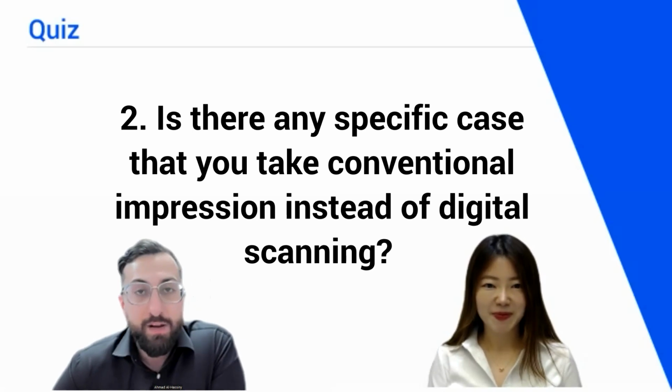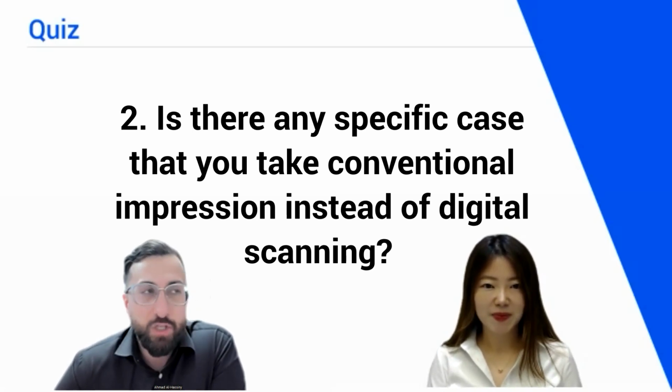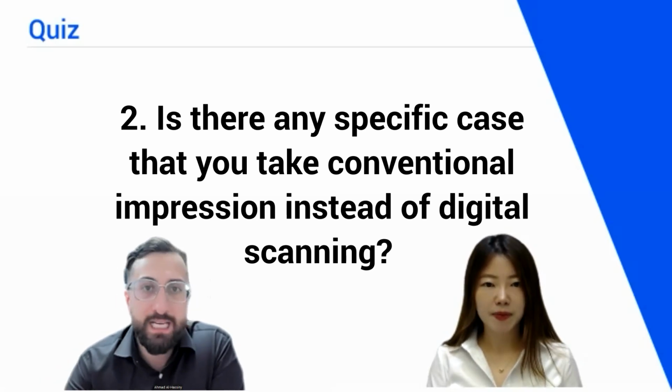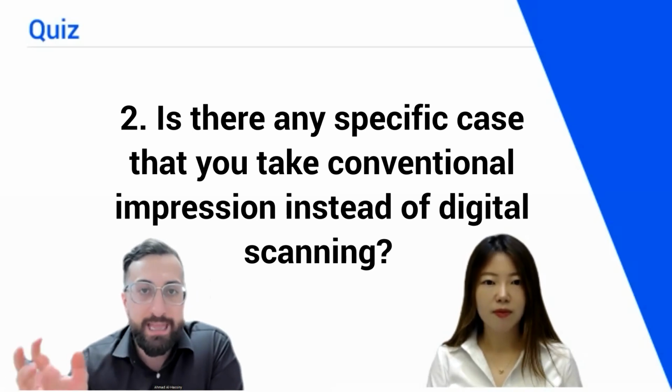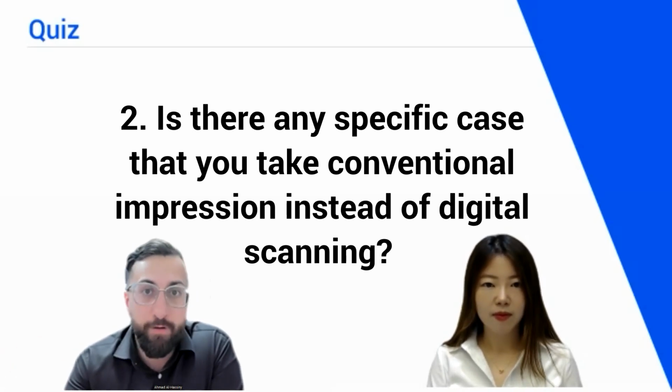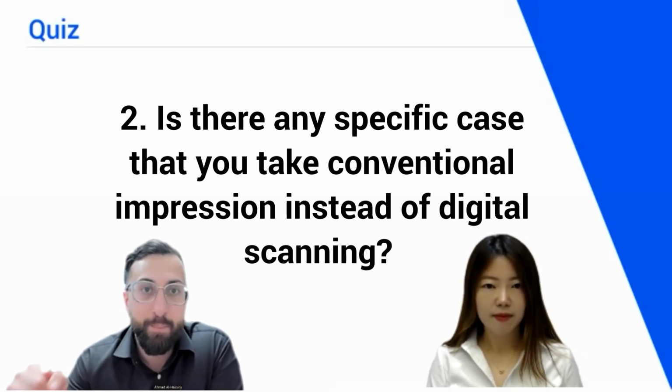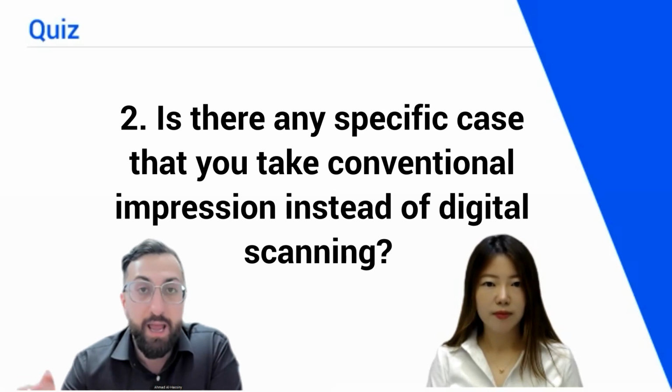Great question. And like I mentioned in the indications part, there's only one time I would do that, and that is for a completely edentulous patient. And that is purely to get a functional impression, if I was going straight to a final denture. If I was going to make them a temporary denture, I would be more than happy to just scan them and make something that's a bit looser fitting. But 9 times out of 10, if I'm seeing a completely edentulous patient, I will take a traditional impression and then scan that impression and send it to the lab.